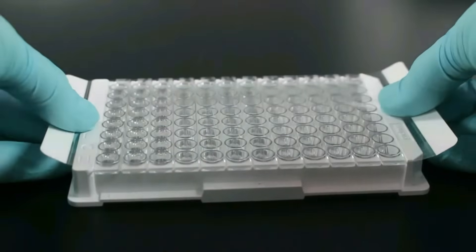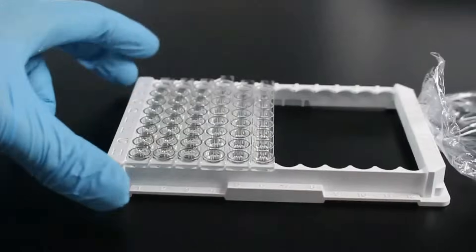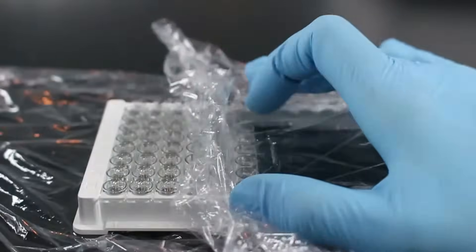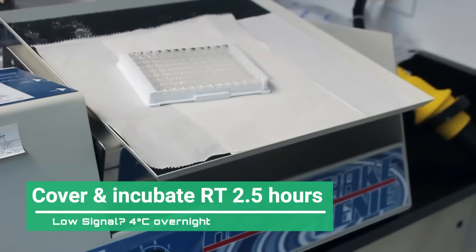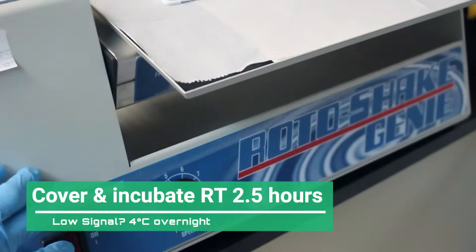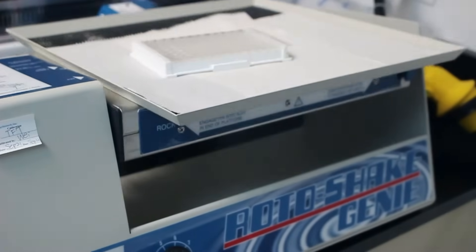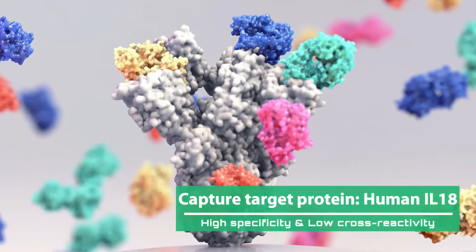Seal the ELISA plate to prevent contamination. If you are running fewer strips, you can use plastic wrap. Cover and incubate at room temperature for two and a half hours. If you have low signal, you can incubate at four degrees overnight. Many times, this is recommended. During the incubation, the target protein will be captured with high specificity and low cross-reactivity.